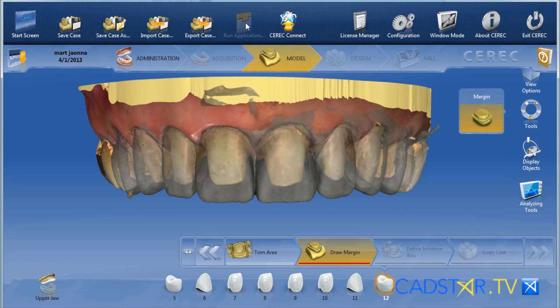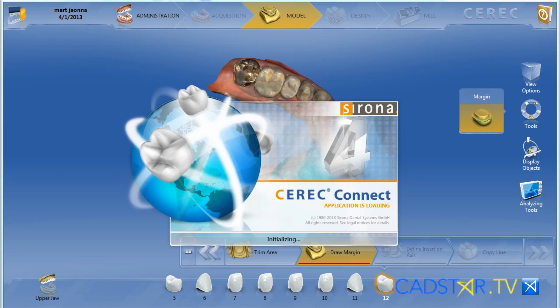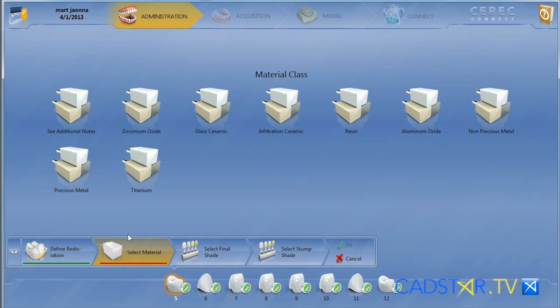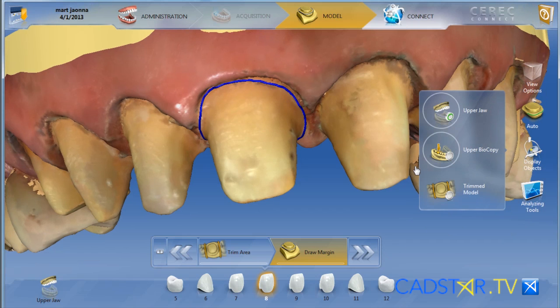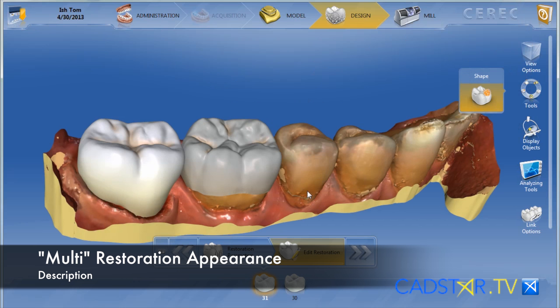Another nice feature is CEREC Connect. Directly from your CEREC screen, once you've scanned, if you decide you need a CEREC Connect input — maybe you're going to do zirconium rather than Emax — you just go to your systems menu, click the CEREC Connect icon, and it will transfer that information over, open that window, and allow you to move into the CEREC Connect process. They've done a great job with that.